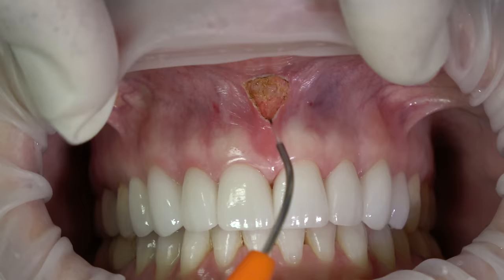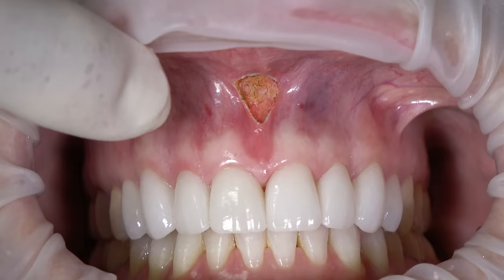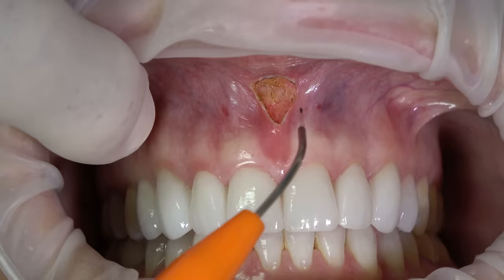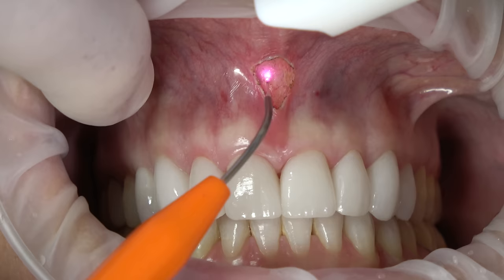You can see as I pull up on this lip, we're still getting some fiber pull laterally. Sometimes this final surgical site will be football-shaped if the fibers are going more laterally; sometimes it's just almost a round type post-operative site.